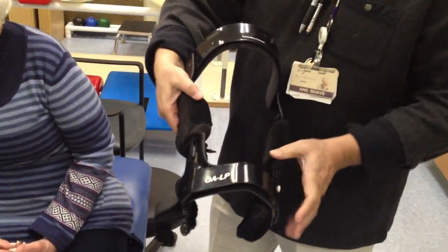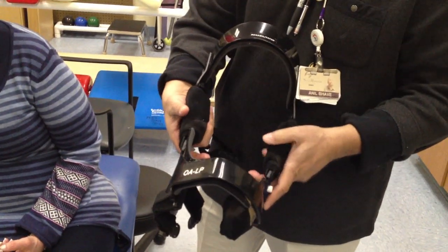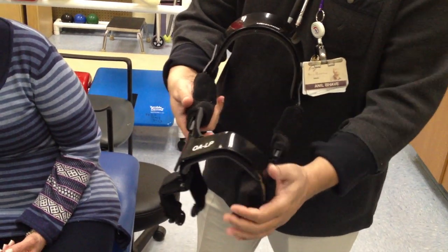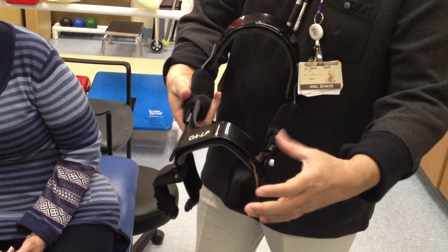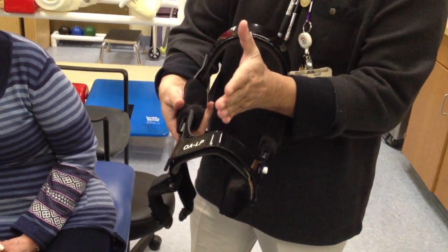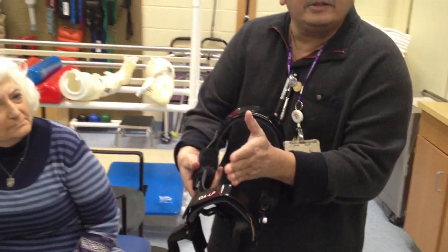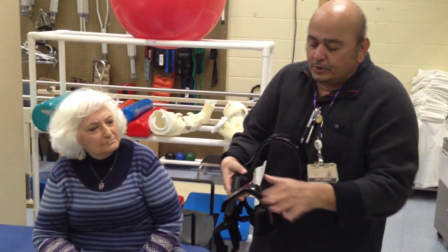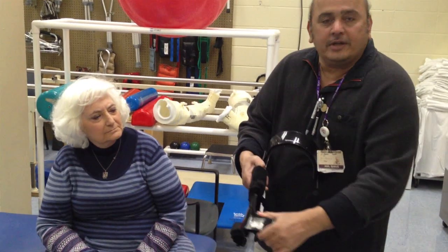One is that it's got air bladders — one air bladder right here, one air bladder right here. When you inflate the air bladder, it actually changes the angle of the knee or deformity in the knee and takes the weight off from the area where there is pain.